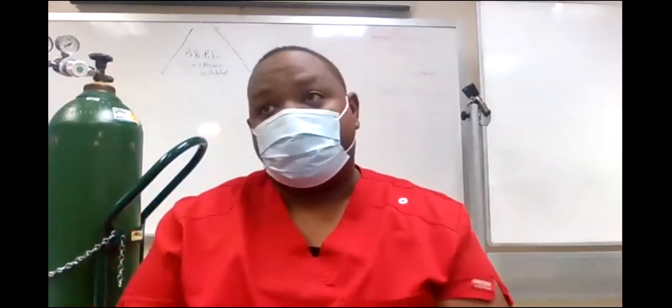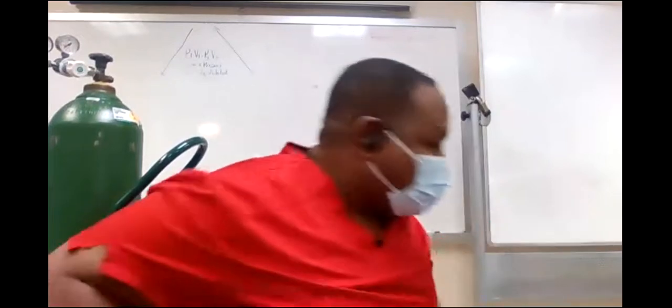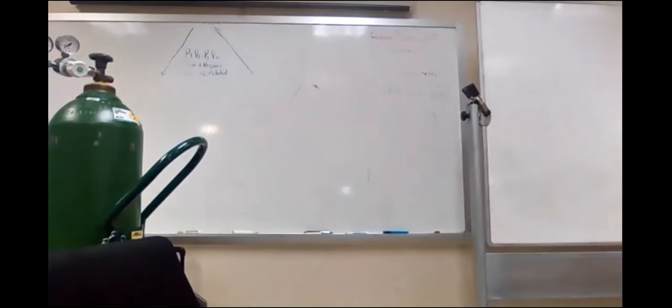Now, bigger than that, sometimes we need to give a patient a little bit of moisture with that high flow. The Venturi mask has low concentrations, but it's a high flow system. But when we go into the aerosol systems, anytime we put water on it, it's called aerosol. So let's look at the aerosol setups. This is the aerosol: one large bore tubing, two large bore tubing, drain bag, whatever's on the end.